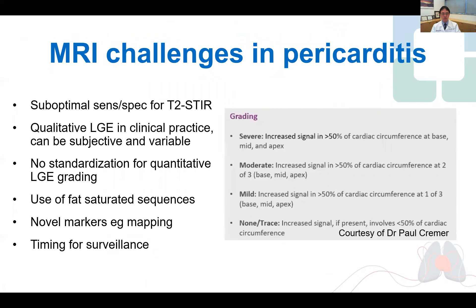Of course, there are also some challenges of MRI in pericarditis, which includes the T2-STIR sequence having suboptimal specificity, especially in the setting of artifact and pericardial effusion. Pericardial enhancement is often graded subjectively because of lack of standardization of quantitative LGE grading. It remains controversial whether fat-saturated sequences are helpful, which we believe they are. Novel markers such as T1 and T2 mapping have limited roles and are only in research at present, limited by the thickness of the pericardium.